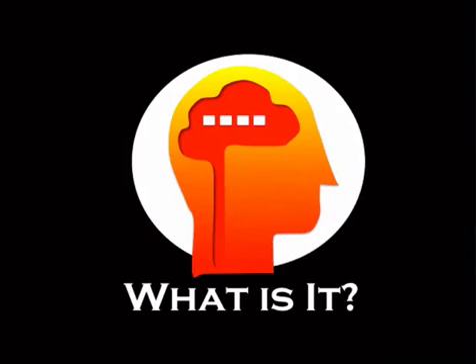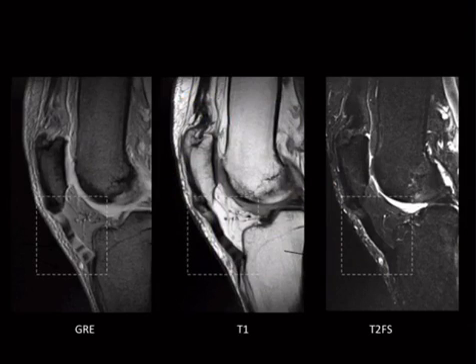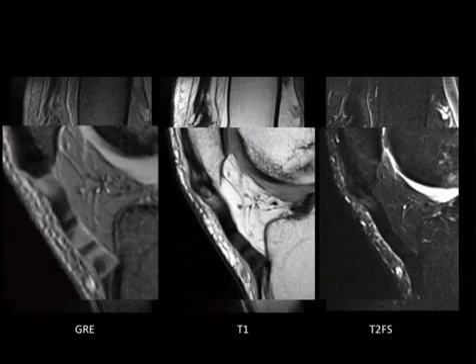All right, so next one. We got 3 images of a sagittal knee. I'll just do a zoom up here on this tendon and make it big. Now notice that there's this high signal here on the gradient. You're seeing it also on T1, but it goes away on T2. This high signal that is persisting is probably real. This is artifact here. So this is one example.